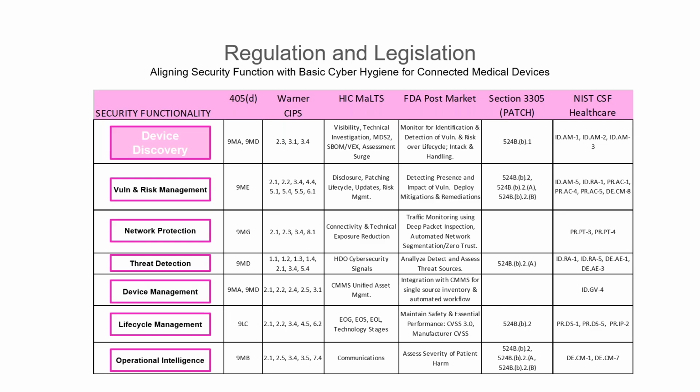Then under number 3, which is changing the market, the White House is saying make vendors responsible for better security tools, not just the medical device manufacturers, but all software, all manufacturers. Stop giving us junk and then we're responsible. We get hit with ransomware, we get fined, the hospital gets fined, we're getting audited. We didn't do anything. We just bought your junk. We're trying to fix it.